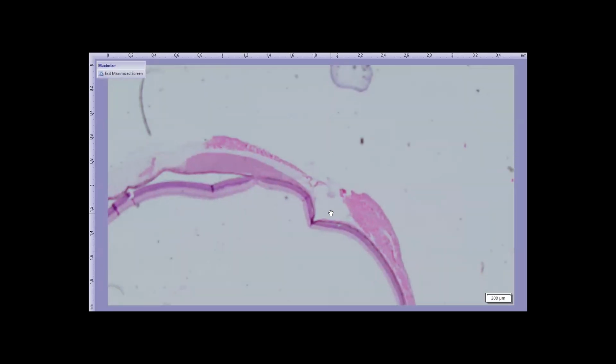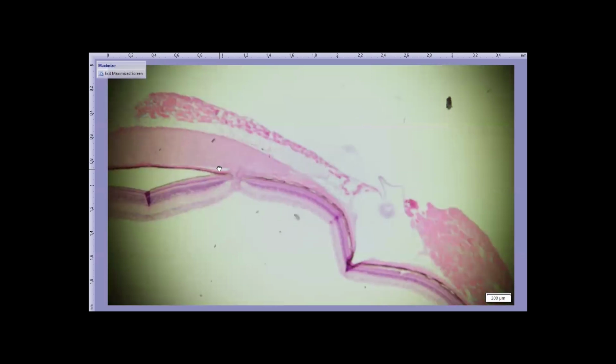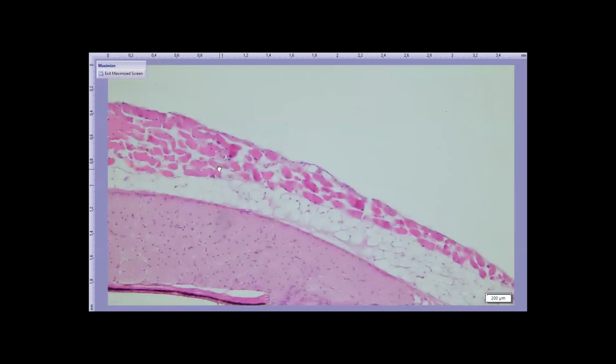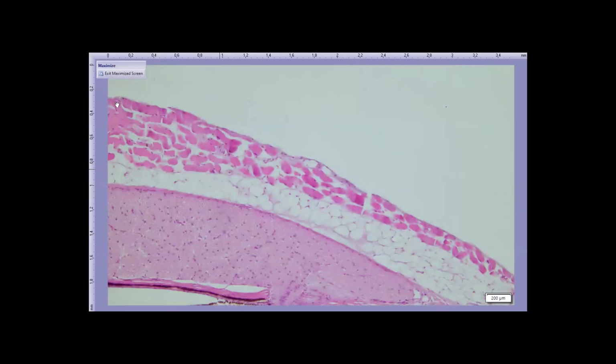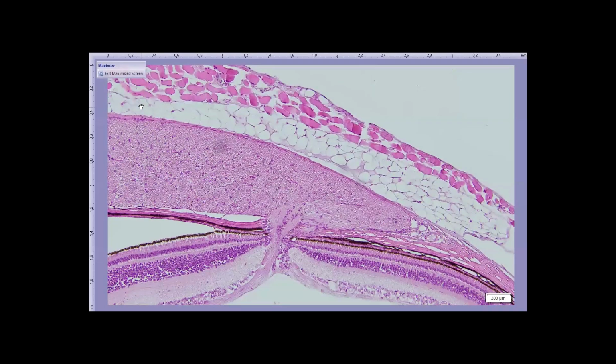So here's the optic nerve. And we're going to center in on that area. Is that artifact going? It's kind of smooshed up against the back of the eye. Sclera. The nerve. You mean the direction that the nerve goes? I'm not sure. The ground squirrel has a really long, flat optic nerve head. Oh, kind of like a rabbit. I have no idea. No. But I know the mouse is, yeah, different than a rabbit. It's like a really long, it's kind of, it's very bizarre when you look at it. Okay. Yeah. So you're three steps ahead of me.